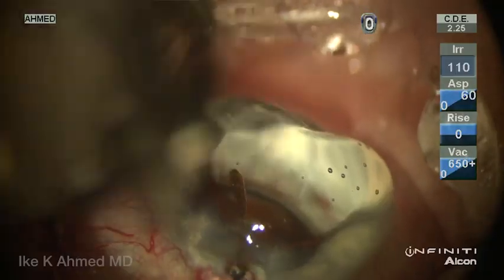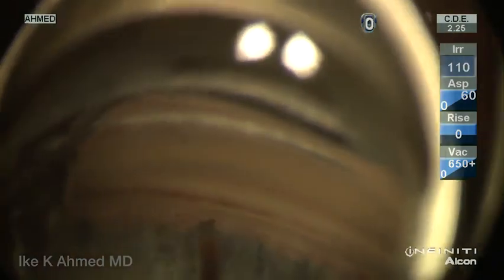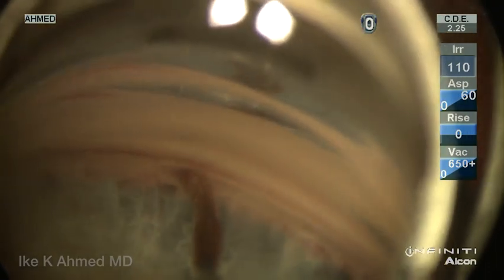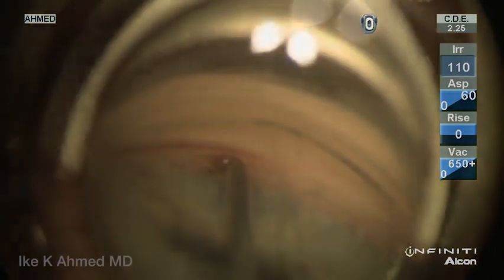So here we have the CyPass that's been loaded onto the guide wire. We're using a TVG lens, a gonio prism, here to visualize the angle. We see the trabecular meshwork, which is pigmented. We basically look at the scleral spur and place the guide wire, the very gentle guide wire, just under the spur here, disinserting the ciliary body iris insertion. The curved guide wire allows it to follow the undersurface of the sclera, delivering the implant.